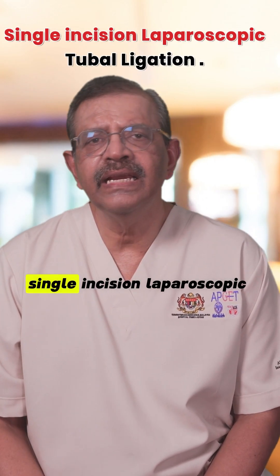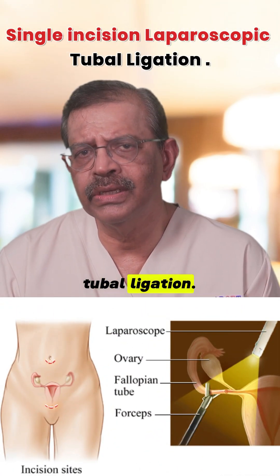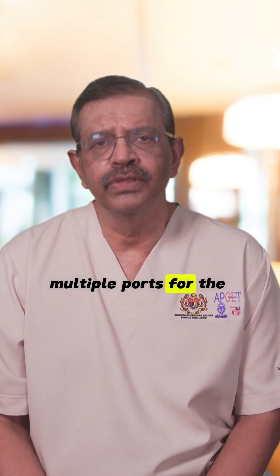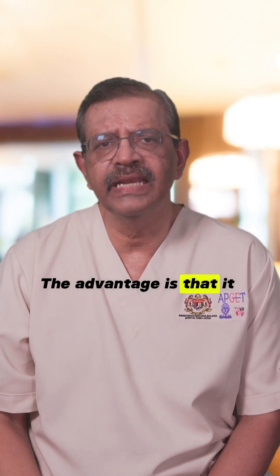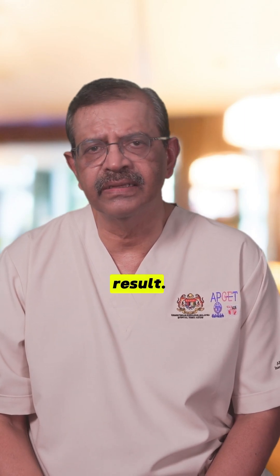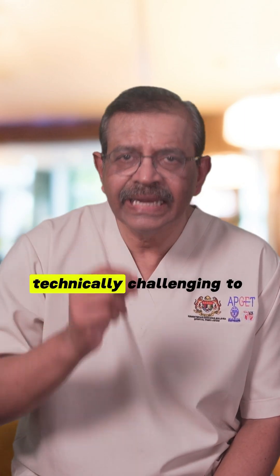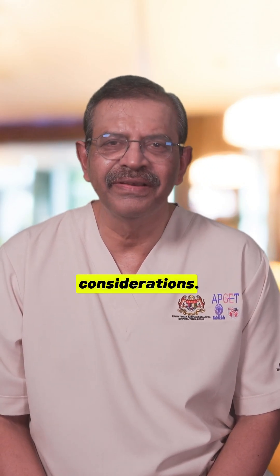Number 4: Single incision laparoscopic tubal ligation. Here, a single umbilical incision is used to place multiple ports for the procedure. The advantage is that it offers a better cosmetic result. The disadvantage is that it can be slightly more technically challenging to perform. Each technique has its own advantages and considerations.